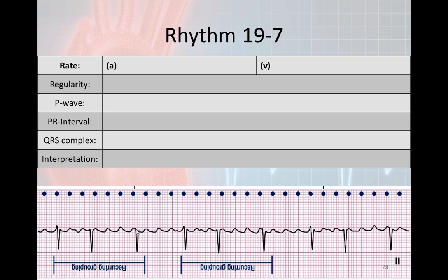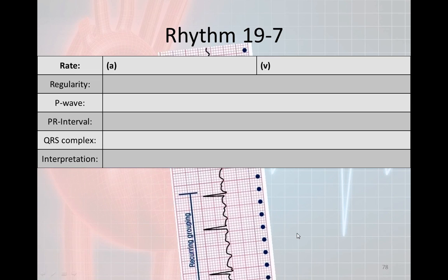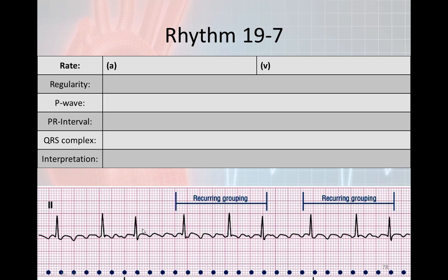It's pretty simple. As you look right across here, you can see the sawtooth pattern. So let me flip this back around and we'll interpret it. We have a trough right here and a trough right here. That is exactly 150, or 300. It occurs exactly on the 300 line. That makes it easy to count the atrial rate.